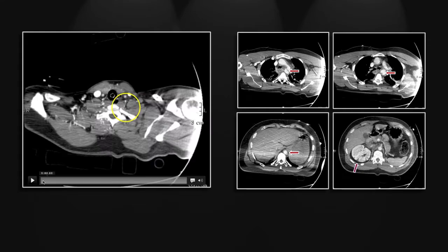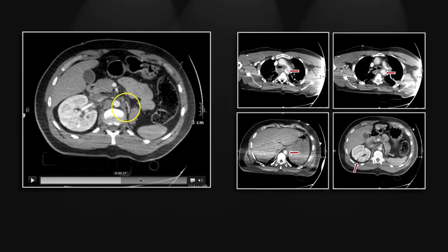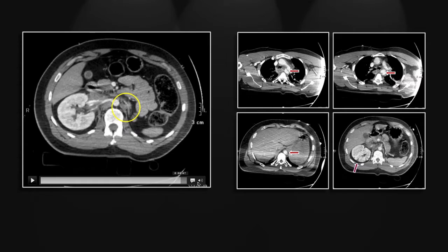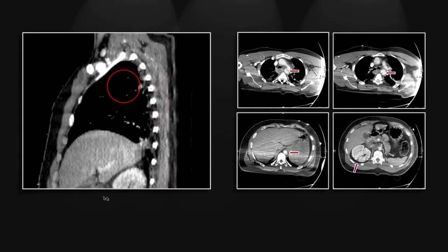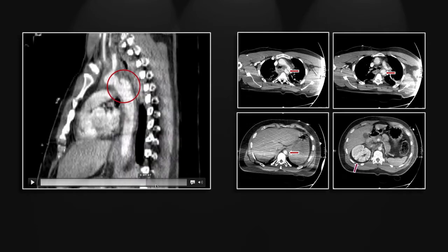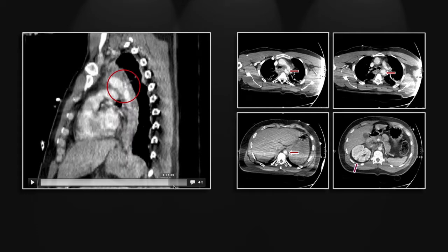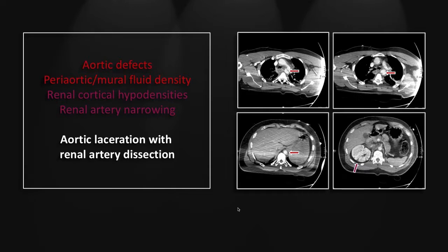Of interest, this patient has a pancake adrenal gland indicating a developmentally empty left renal fossa. This can be seen in patients with a single kidney or a pelvic kidney. Given the presence of compensatory hypertrophy of the right kidney, you can correctly surmise that this is, in fact, a single kidney. Lastly, we can appreciate that aortic laceration on the sagittals — you can see it's a near transection but comes together right there at the lateral wall. So that is an aortic laceration with a focal renal artery dissection.